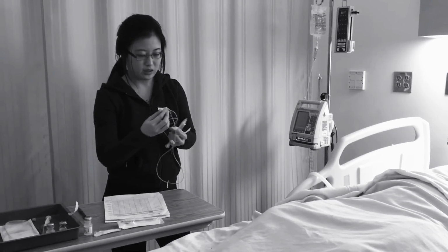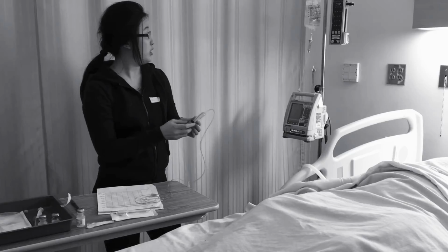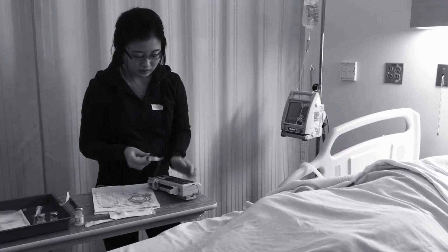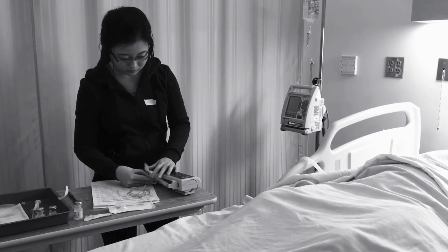Now I can put the IV here, and it's running at the rate that it's supposed to, as well as there's no damage to the bag, so that's good.